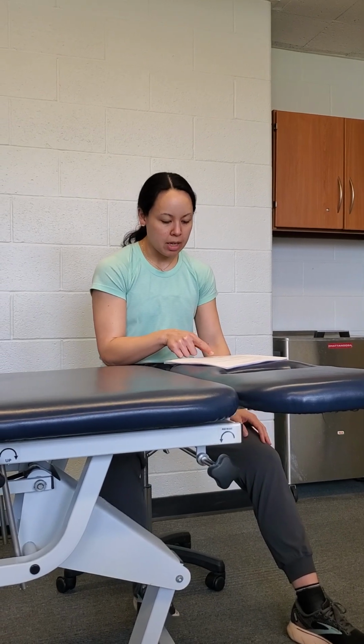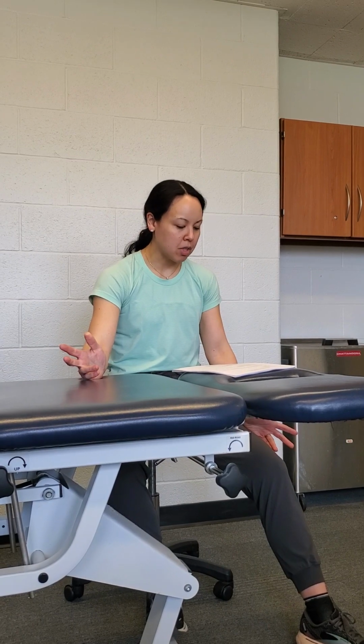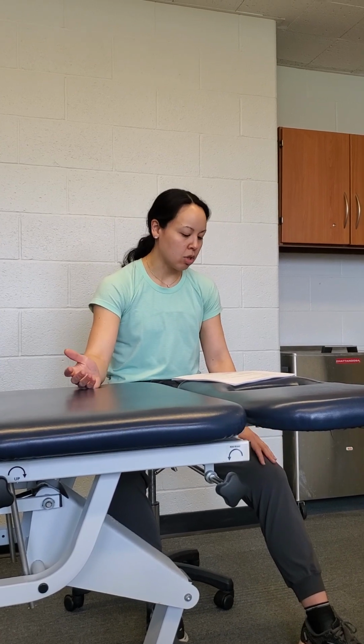The limb occlusion pressure, LOP, is generally the more accepted term, but it's synonymous with arterial occlusion pressure. So if you hear LOP or AOP, they're synonymous terms.